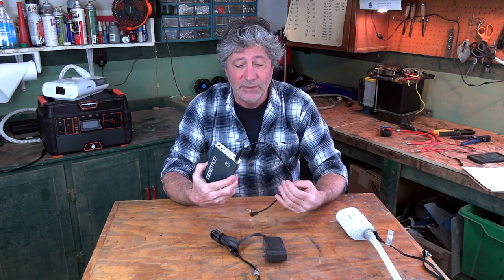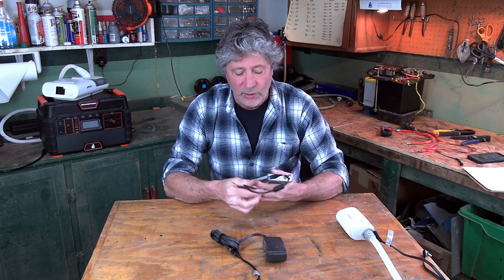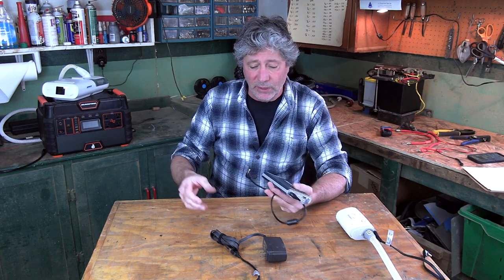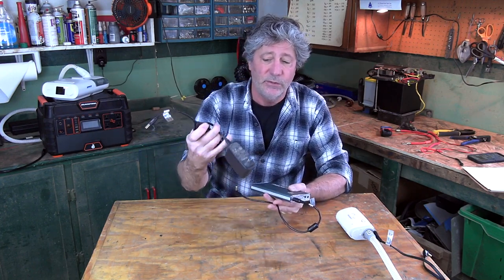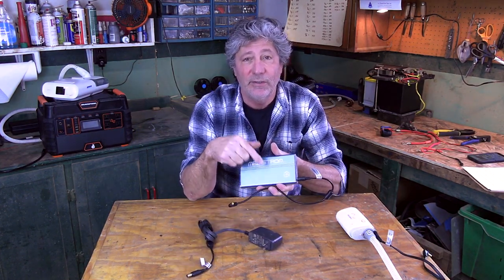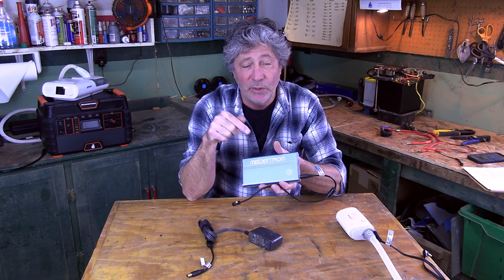My experience with recharging is that using this cord plugged into a 12-volt power unit takes a little under three hours. Using this cord plugged into a 110-volt wall outlet takes about two and a half hours to bring the battery from completely dead up to 100 percent.